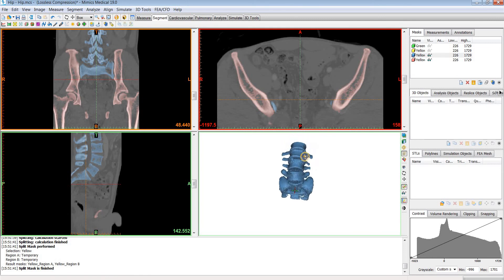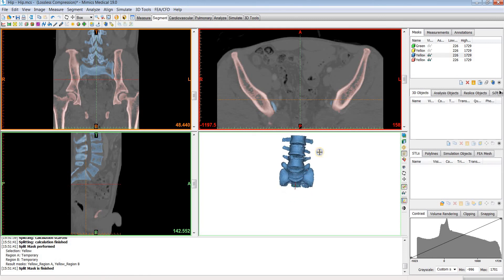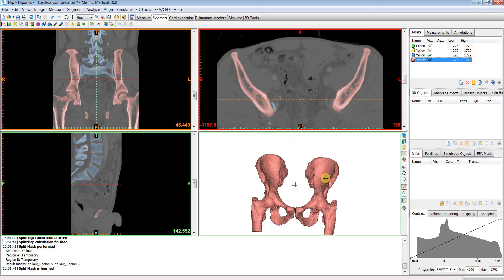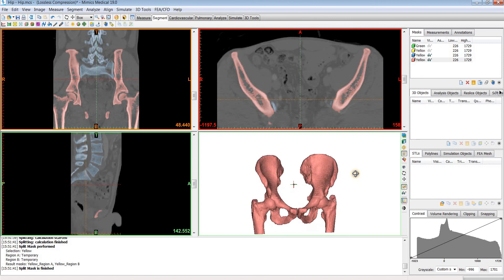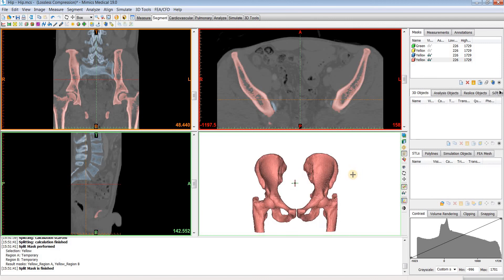You can see it has split off the sacrum for us. We have two new masks now — the blue one with the sacrum, and then the red one for region B that contains the pelvis and the femurs.